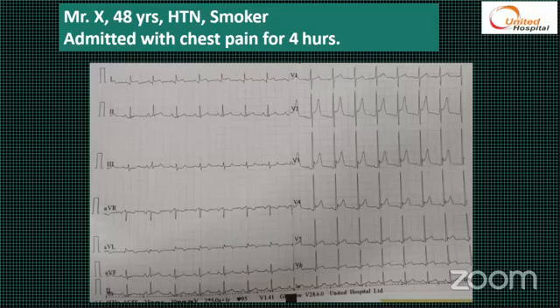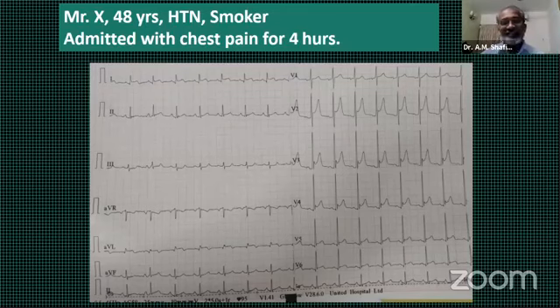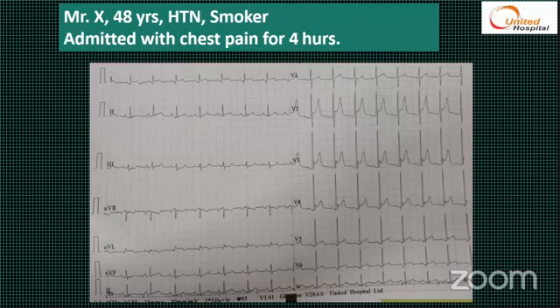Top 3 is acute anterolateral ST segment elevation MI or pericarditis. Pericarditis. I would not even go to the third one here because of how the patient is clinically presenting. If it is in the office setting, then you can entertain J-point elevation, but unlikely. And you can say LVH, which does not fulfill the whole criteria. So the tough one is anterolateral MI versus pericarditis.